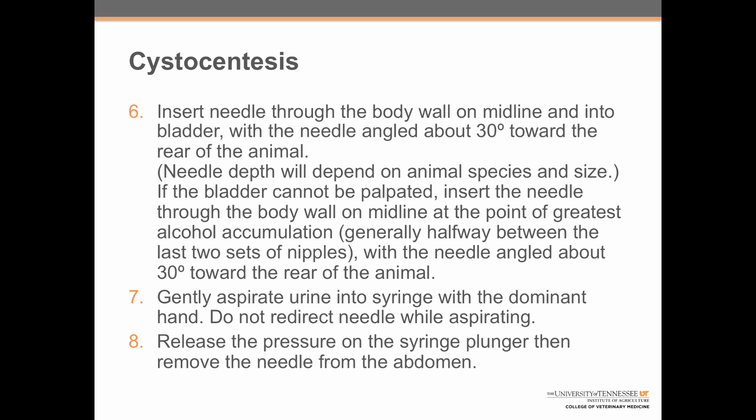Step 7: gently aspirate urine into the syringe with the dominant hand. Do not redirect the needle while aspirating. And step 8: release the pressure on the syringe plunger, then remove the needle from the abdomen. Now it's your turn!